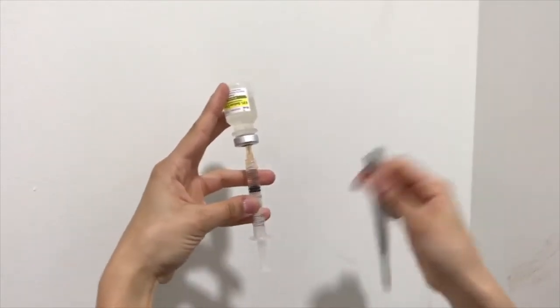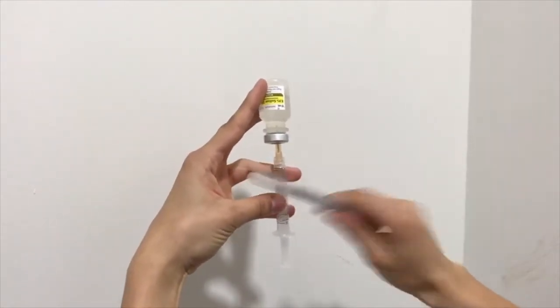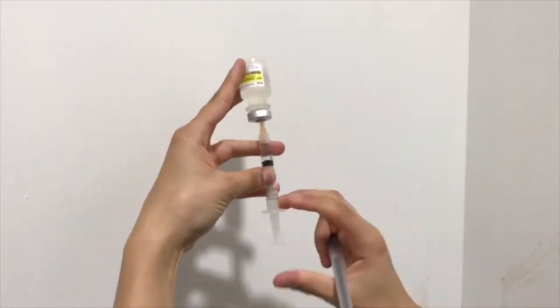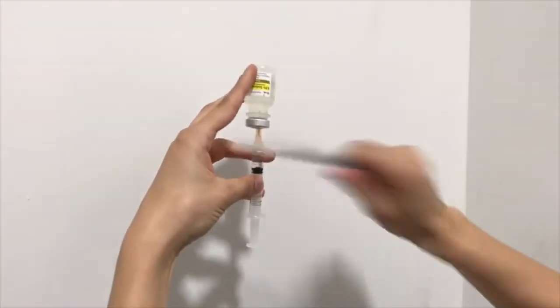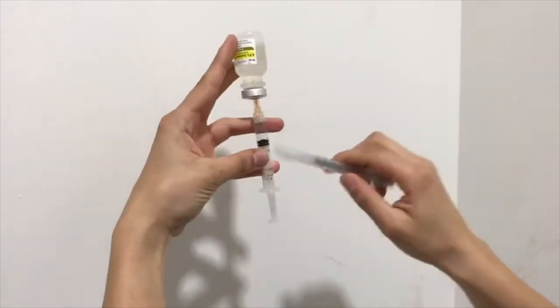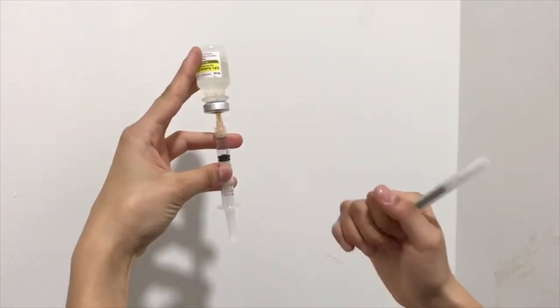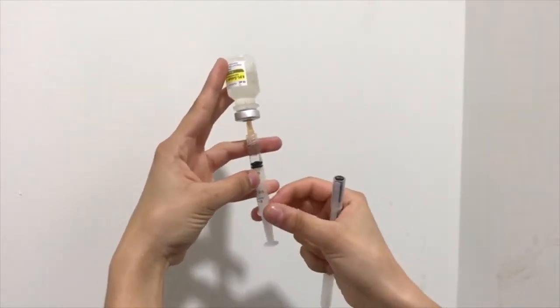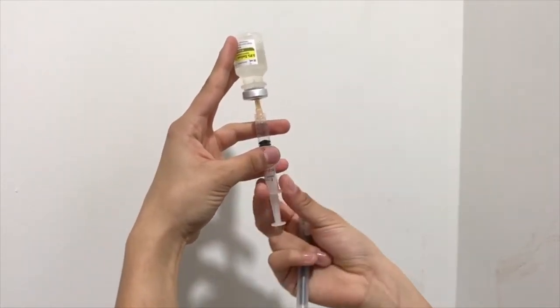So what you can do is you can take your pen and just hit them all the way up, as you can see, and we still have that air bubble at the top. Because of hitting it with your pen, you can hit it with your finger, but I just find it easier with the pen just so that you don't hurt yourself. As you can see, there are no air bubbles at all here.